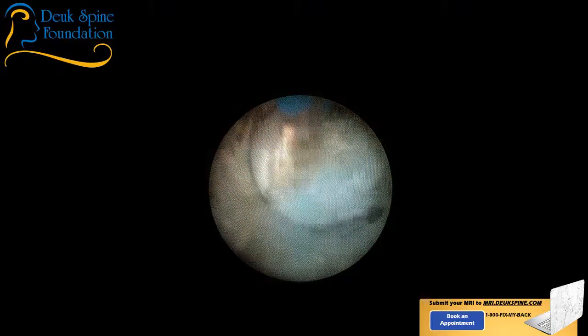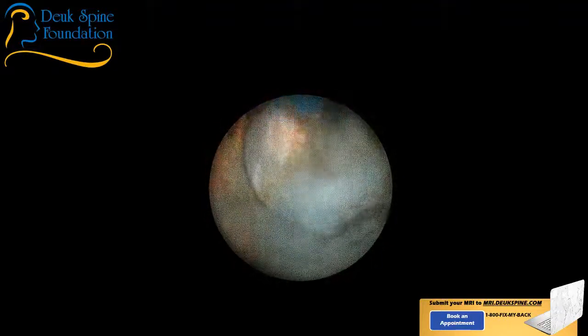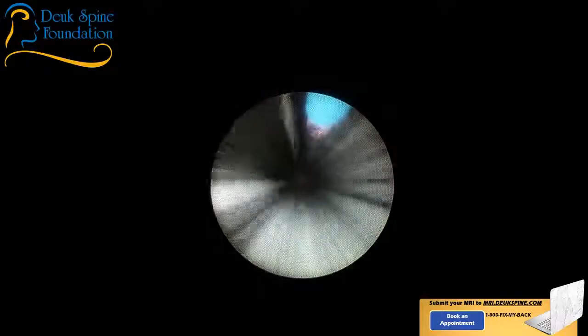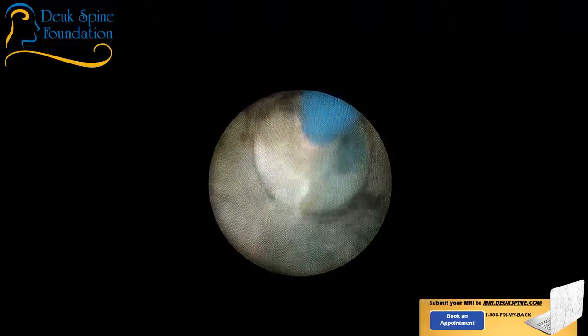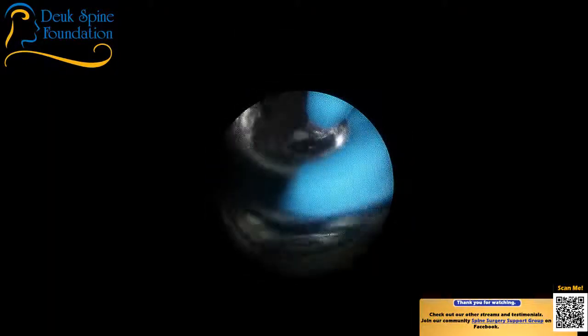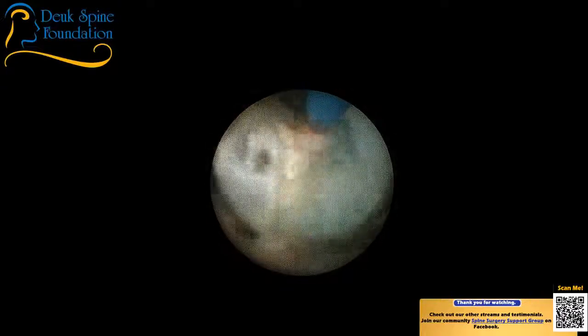As a matter of fact, that right there is a bone spur. See that? I'm blasting right now. It's not a big bone spur, it's a small one. I'll bet you would be able to get this surgery done. I just need to see your MRI to confirm that. I'll show you some more bone spurs in a minute. These are all little pieces of herniation. Remember, I told you they don't come out as one piece, unfortunately.